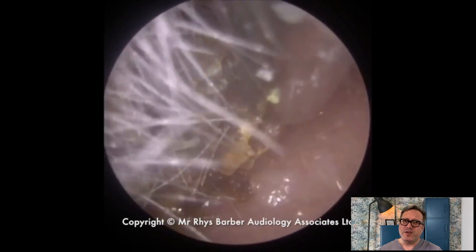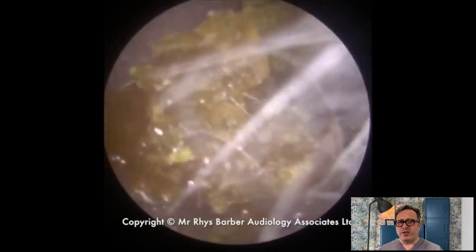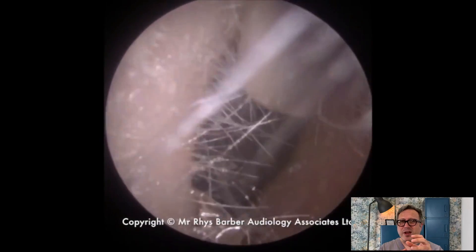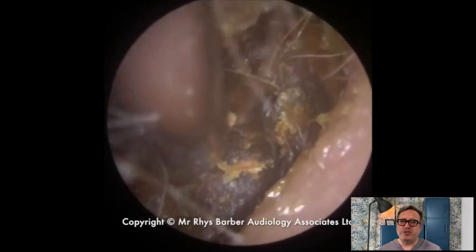I managed to get a little bit of purchase on this piece of wax on the left hand side — a bit of olive oil in there as well just to loosen this along — so you can see it's coming away almost like a dry skin plate. It's quite common to see this kind of issue with people who have drier skin conditions.